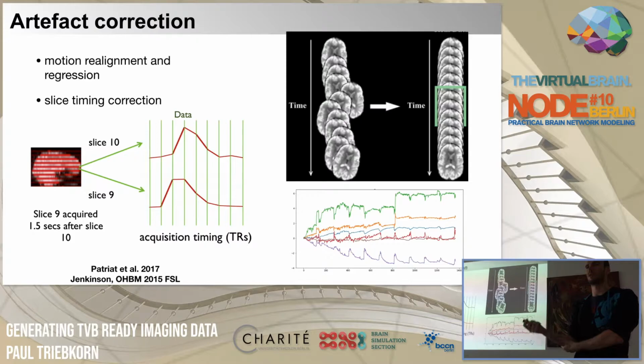They have to, I don't know, calculate, do a motor task, remember something, a mathematical task, and so on and so forth. So there are different modalities there. However, if we acquire the whole brain volume, let's say this is TR, repetition time, let's say every 2 seconds, or with very advanced scanners or new imaging protocols from HCP, they acquire one every 0.7 or 0.8 seconds. So you get one volume for each time step.